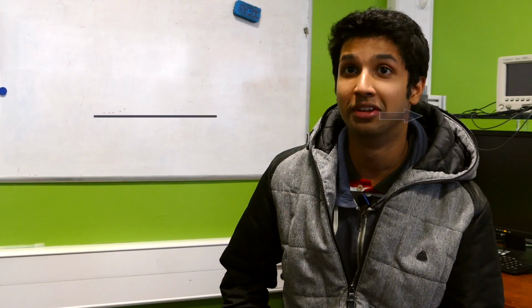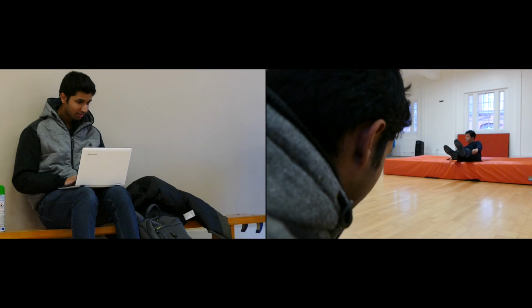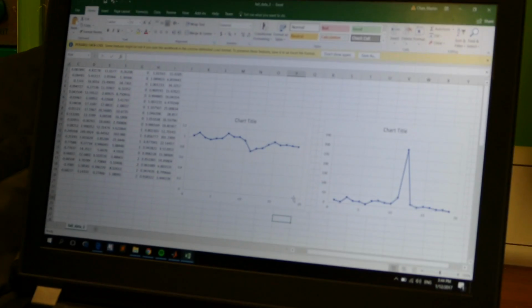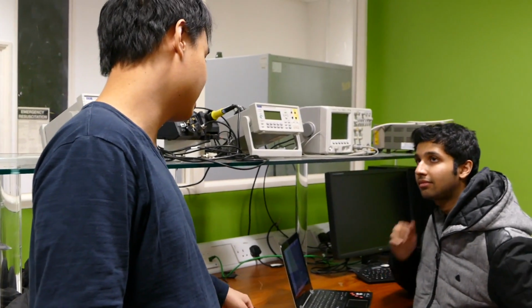So I worked on the fall detection component of the smart walker. This component uses the data from the IMU sensor and the gait analysis. The way we do this is using a threshold detection method. As soon as we detect a fall, we try to apply the brakes. After a while, if the user is not being detected by the Kinect camera, then we say the user has probably fallen, and then we alert the emergency communication.